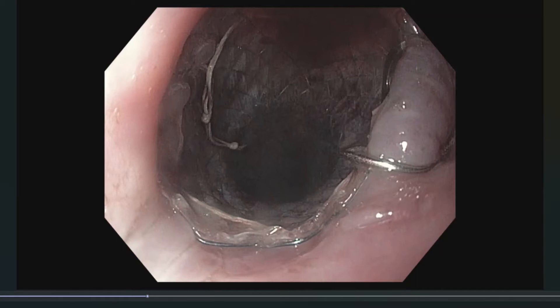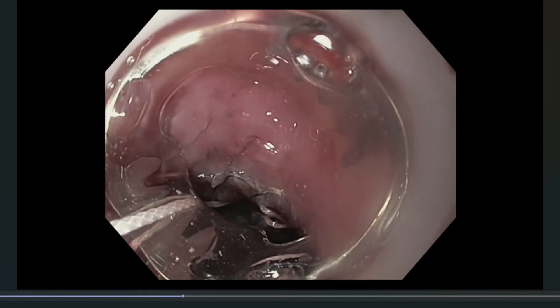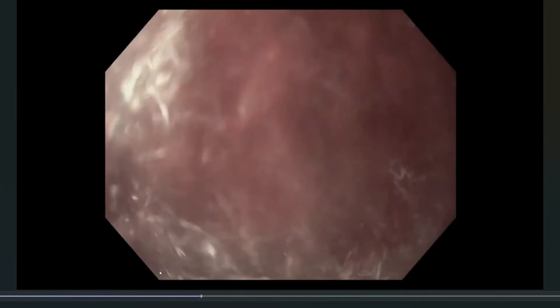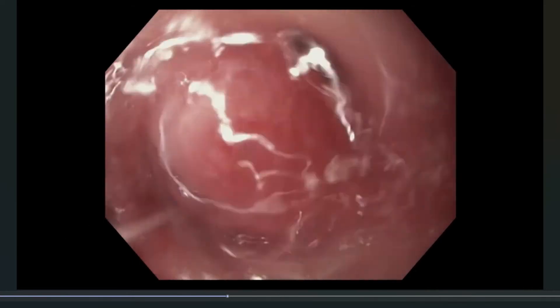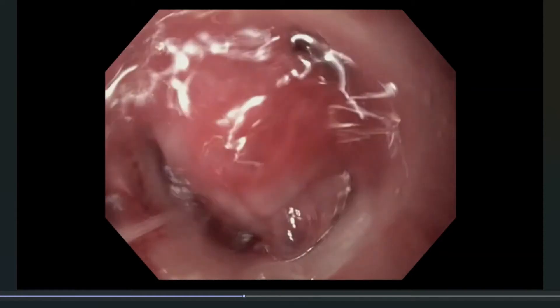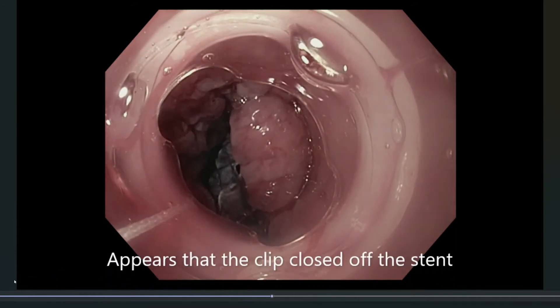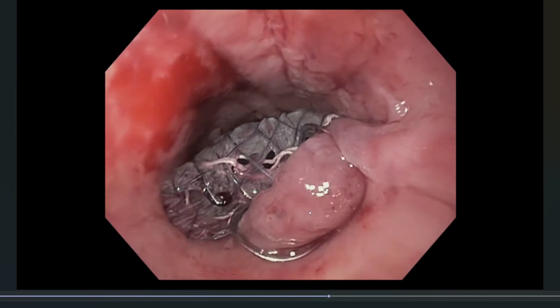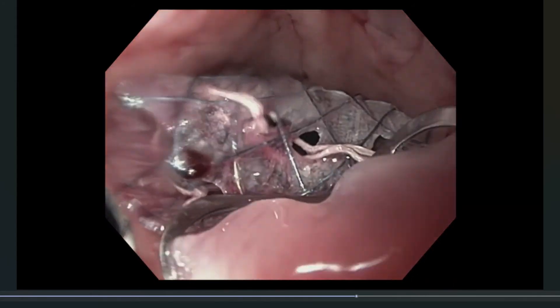In this video we'll showcase a scenario where the stent fix deployment didn't go as planned, and show a way to fix it. The stent fix device is loaded properly and advanced to the proximal end of the stent — this is also in the esophagus. The stent was aligned, and a lot of mucosa is being sucked in, but as you can see, you can't really see the stent being captured, and you don't know how much of the stent is being suctioned in. The clip is deployed, and it looks like too much of the stent got captured — not only one end but the contralateral end also got sucked into the cap. Therefore, the stent appears collapsed or closed off by the clip.